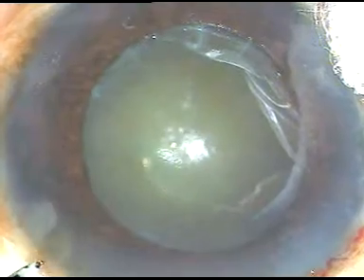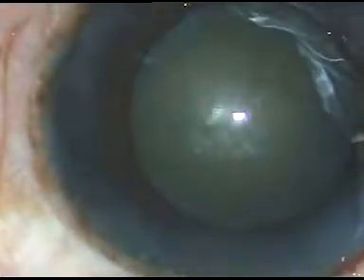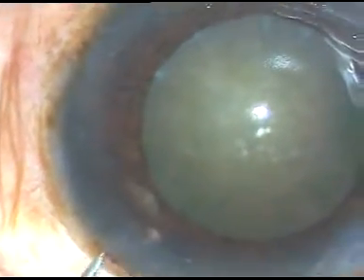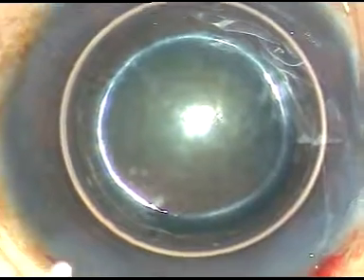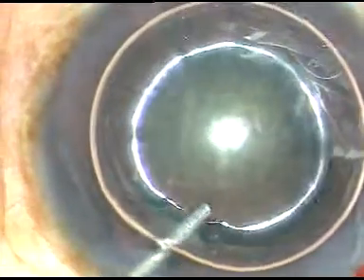By this time, main incision has been made and one stab incision has been placed on the left side of the main incision. Now I am going to stain the anterior capsule so that I can demonstrate capsular Rhexis very clearly. The anterior capsule is being stained underneath an air bubble. This is trypan blue dye.